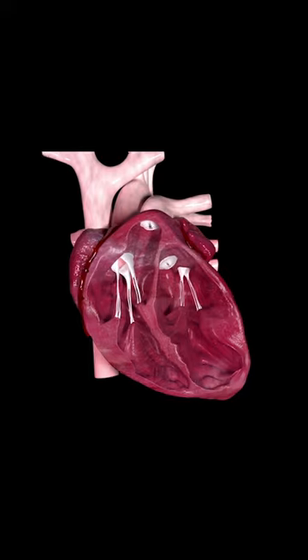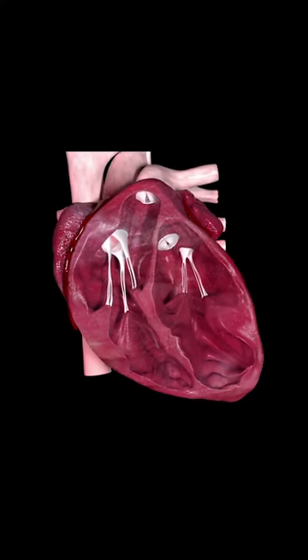Lub is the first heart sound you hear when the mitral and tricuspid valves close. This is when blood from the atria fills the ventricles, then the ventricles start contracting and close those valves. The second sound you'll hear is the dub sound.